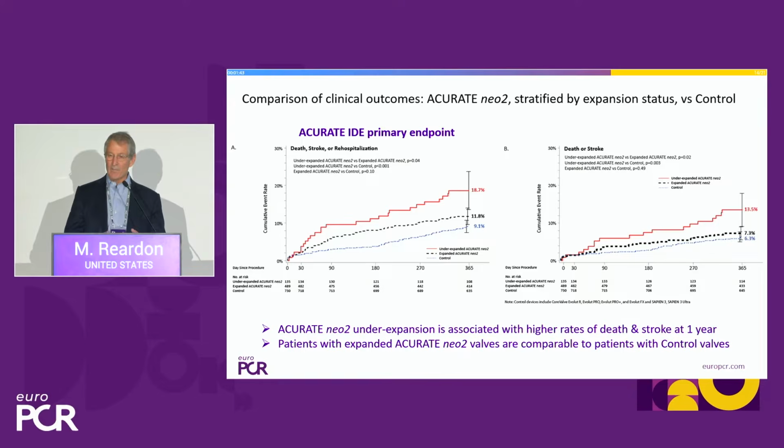We just weren't aware, when we ran this trial, of how to look at these valves. We were doing them in coplanar, not in RAO. Most of the underexpansion we see is in an RAO or a cusp overlap.